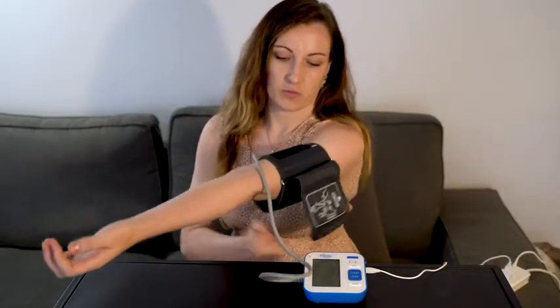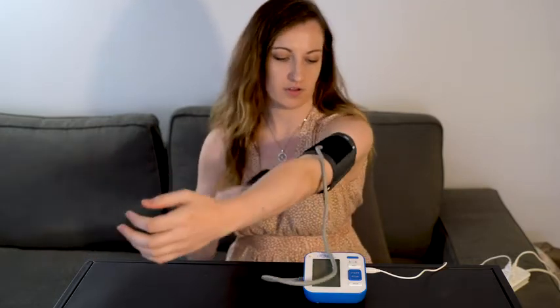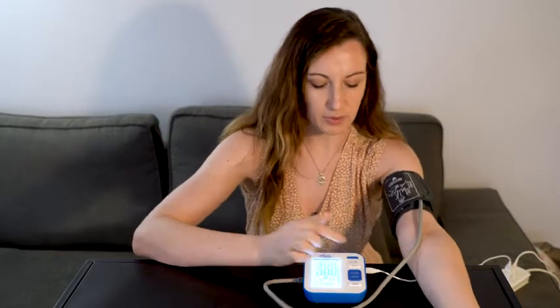First we pull it on, adjust the strap and open the velcro, tie it round, and then we press the start button here and you'll see it starts to work. The whole process takes around 30 seconds. You can see it's starting to inflate now.